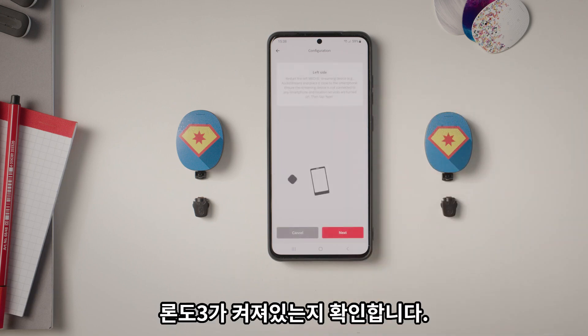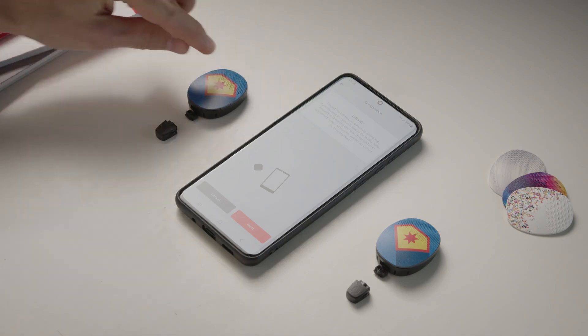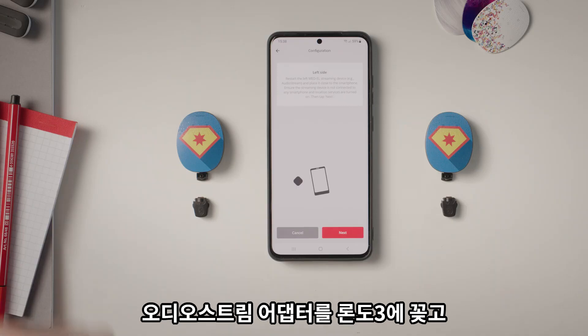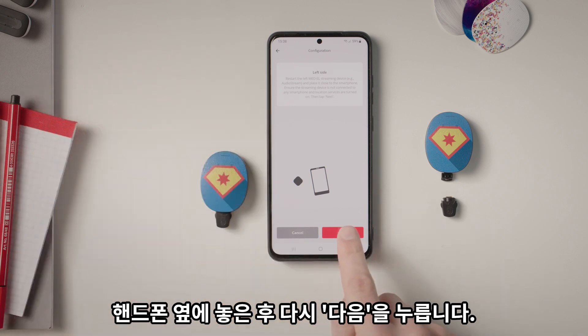Tap Next. Check that your Rondo 3 is turned on. Plug the AudioStream adapter into your Rondo 3, place it next to your phone, and press Next.